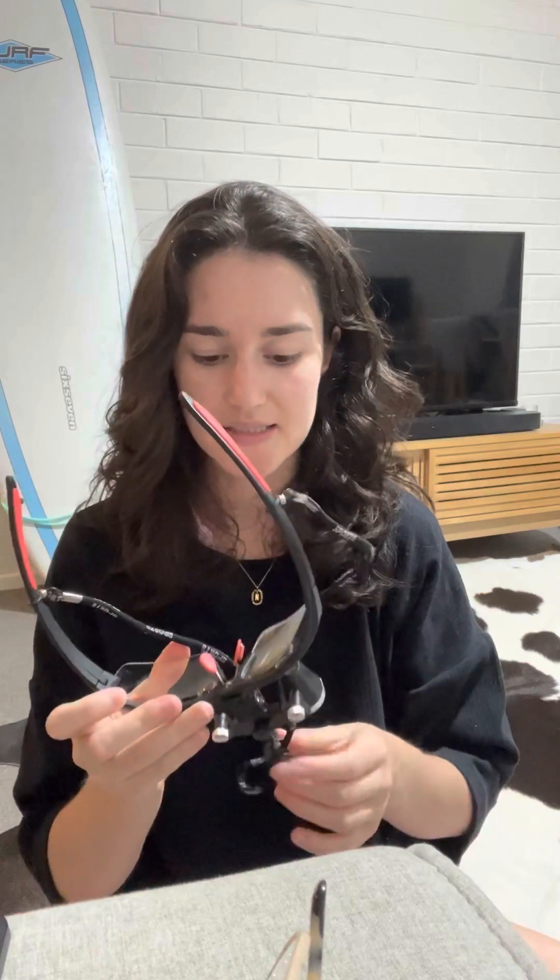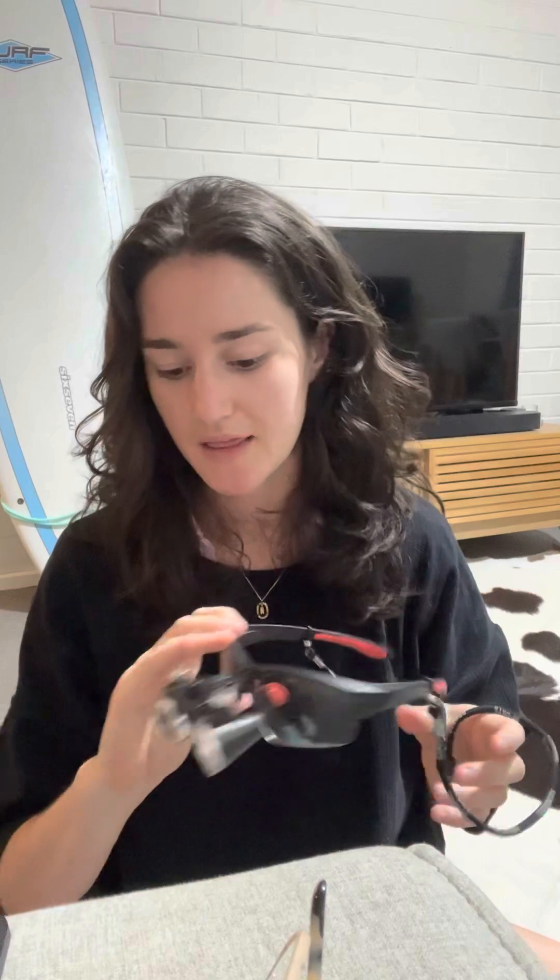When I tried these in clinic, honestly, they're amazing. They're crystal clear. So yeah, you've got really good vision. I found that I had a lot better posture.